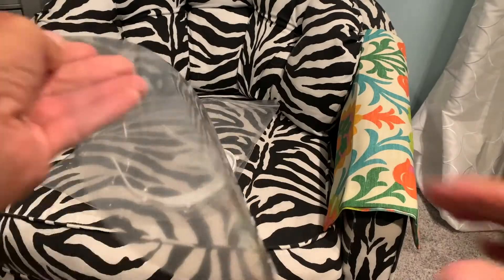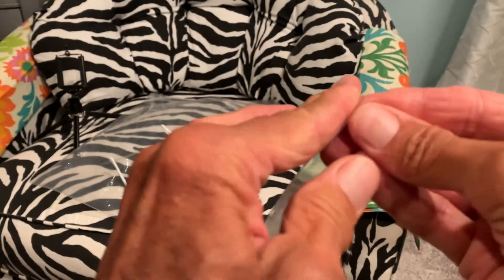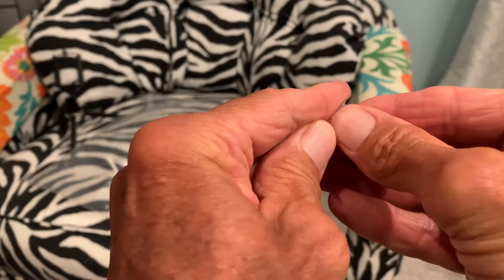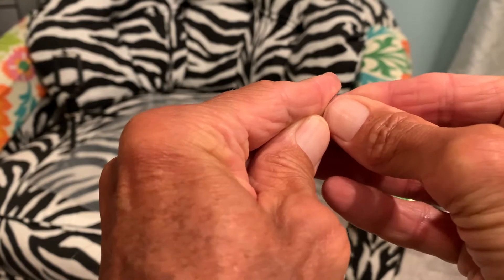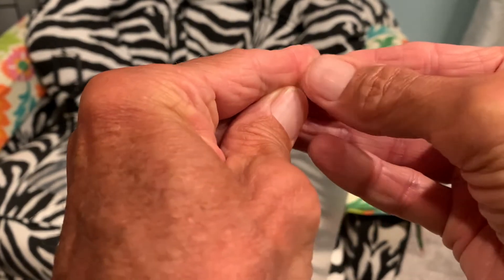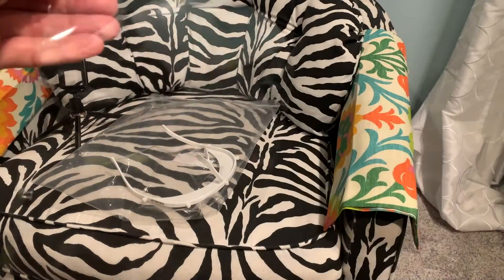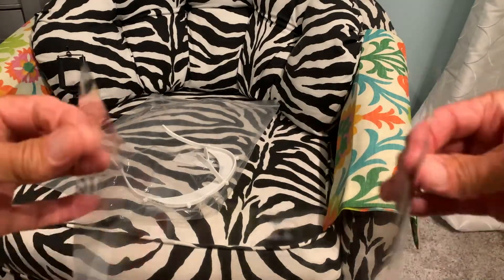And you've got to get it off this side too. You'd think it would just come right off, but — there we go. I had to use my fingernail. Done.